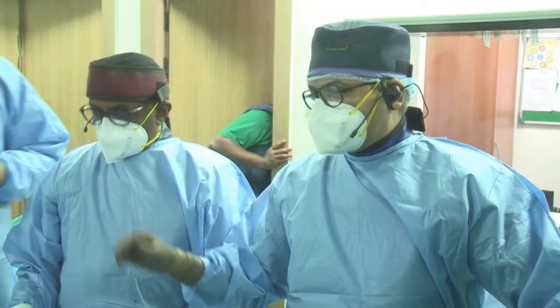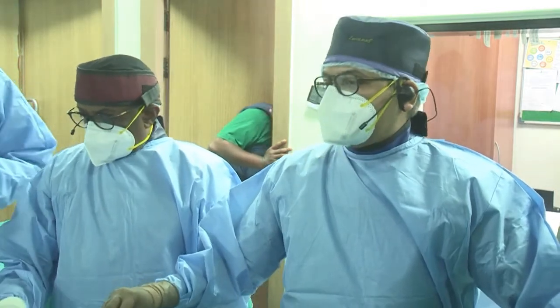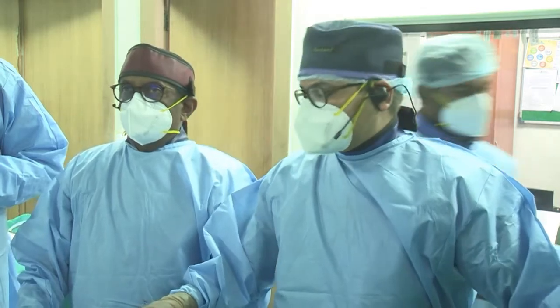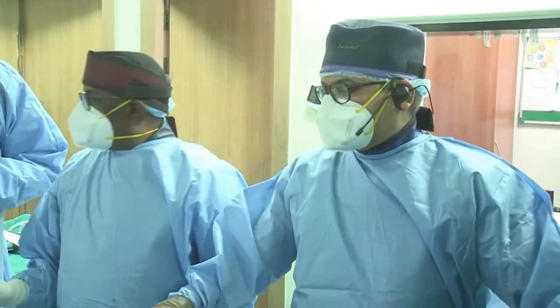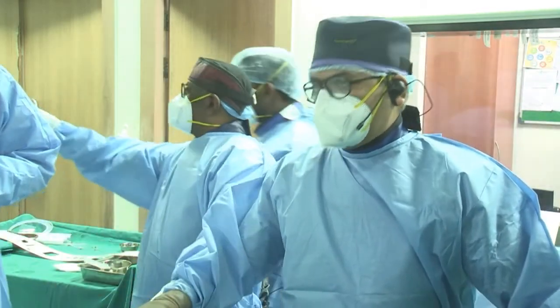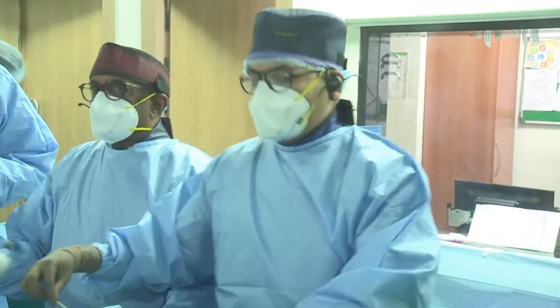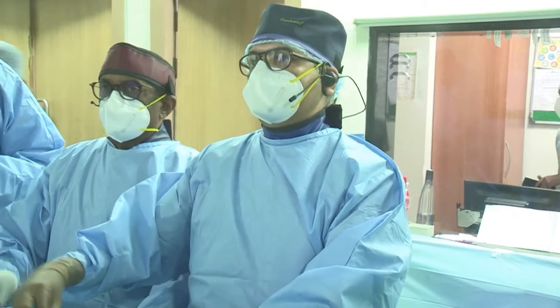This is just for the live case purpose. We are three of us over here. But otherwise, I've been routinely doing it alone with my staff nurse who is there to assist me. It is not that difficult. But you definitely need somebody. We need somebody to hold this wire.